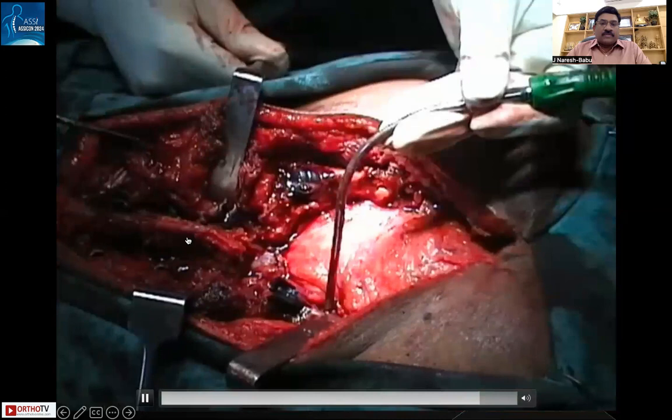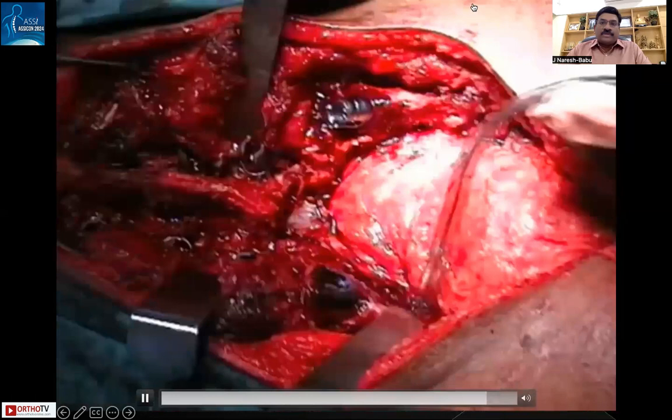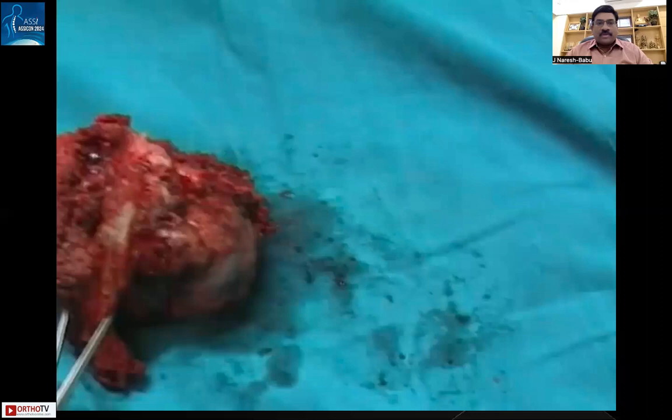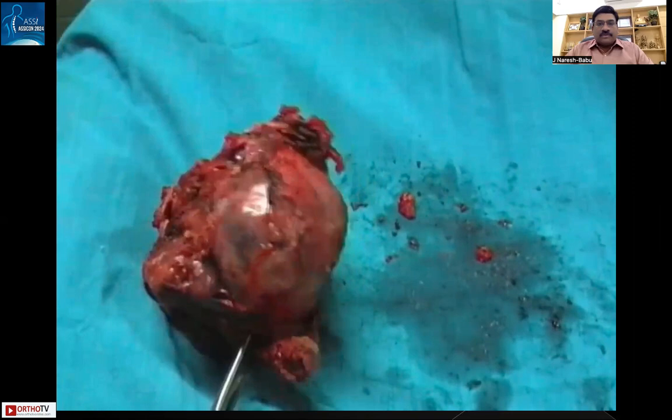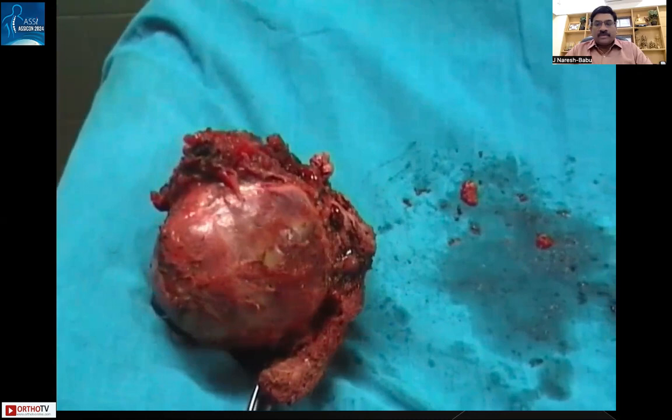Once the tumor is removed, the spine must be stabilized with spino-pelvic fixation by connecting the rods. The retroperitoneal fat pad is now visible from the posterior. Closure is a major challenge — the gluteus maximus must be mobilized bilaterally to cover the defect, and sometimes a rectus abdominis muscle flap is required to cover the wound. Without adequate soft tissue coverage over the large dead space left by the removed sacrum, significant wound healing complications can occur.